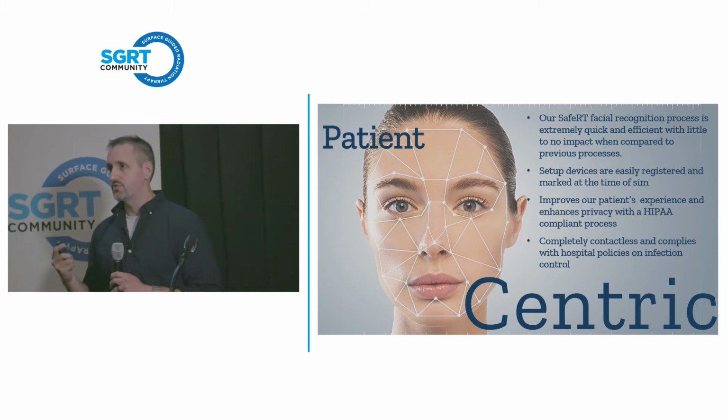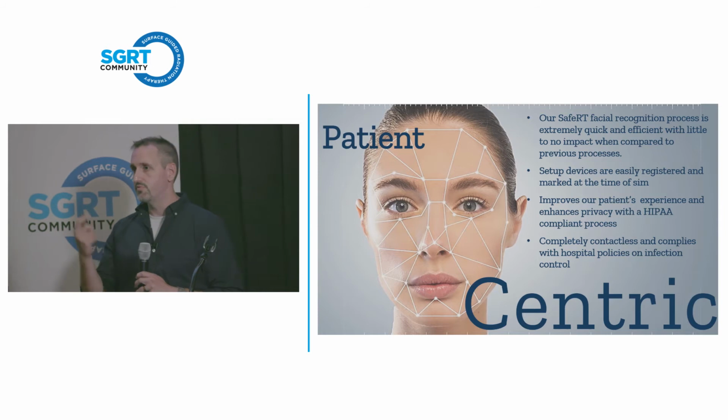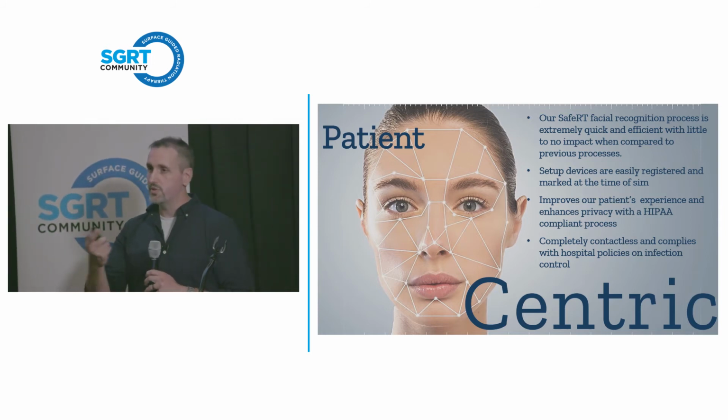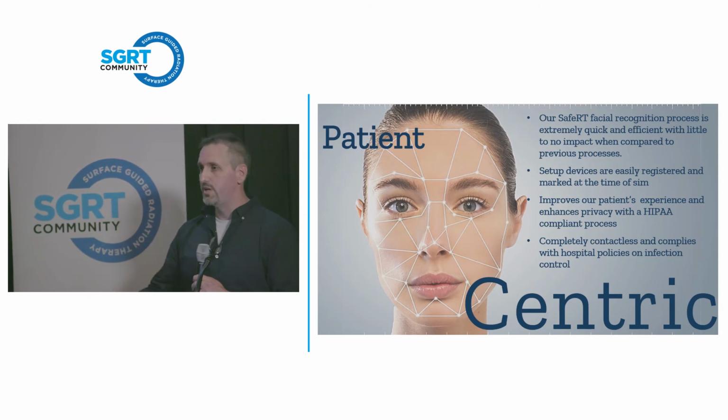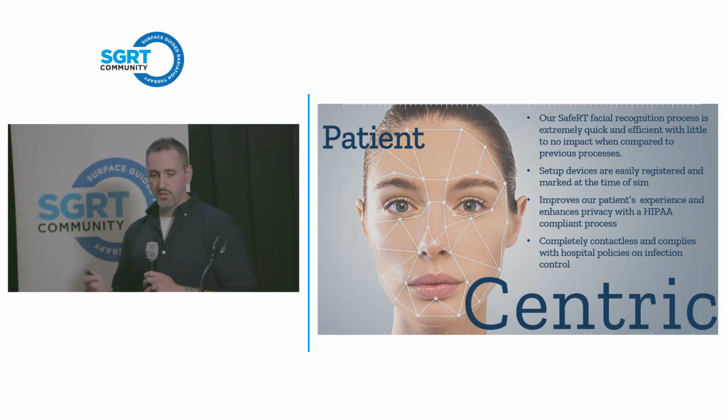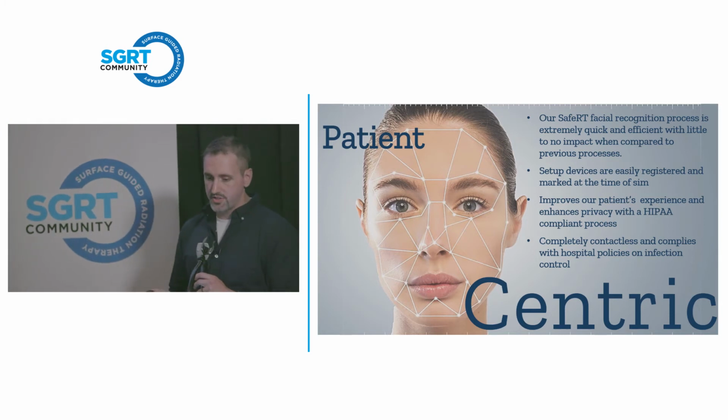They walk past the facial recognition camera, they look at the camera, and it flashes green to let them know they're there. It takes about 30 seconds. And we always put that in a place where they're already going to stop, where they're putting their keys down, where they're taking their shoes off, something like that. And so it's very quick and easy. The setup devices are easily registered, as I said.